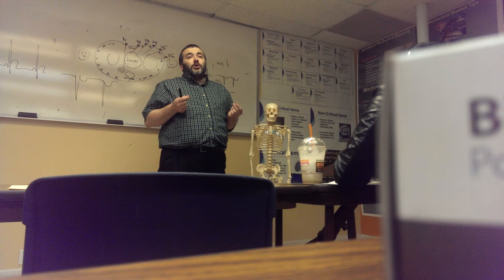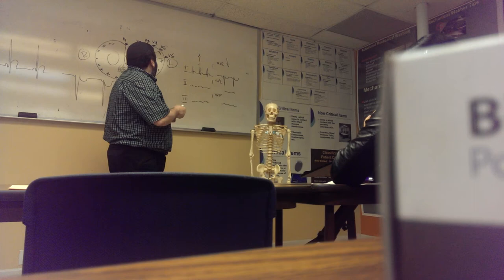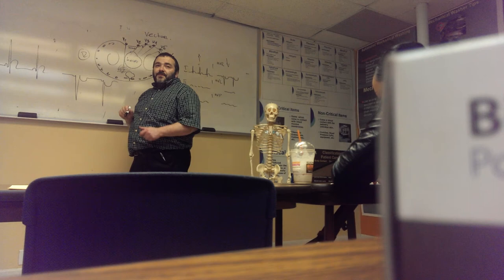Is it also called precordial? They're also called precordial leads, okay? But they're most importantly called vector leads because they're marked by letters V1, V2, and V3. These are called vector leads. Does this make sense?